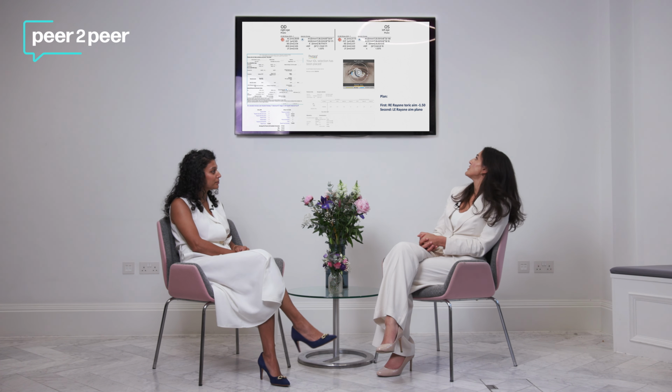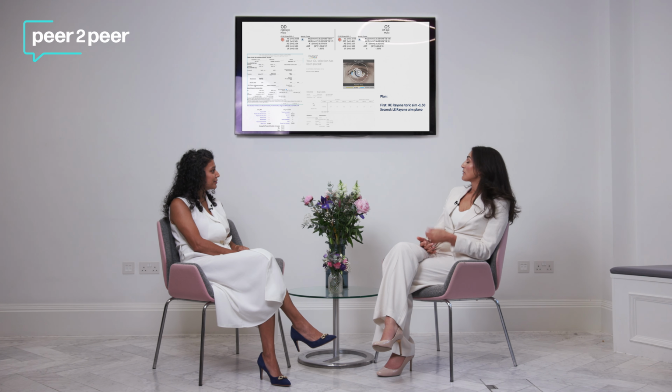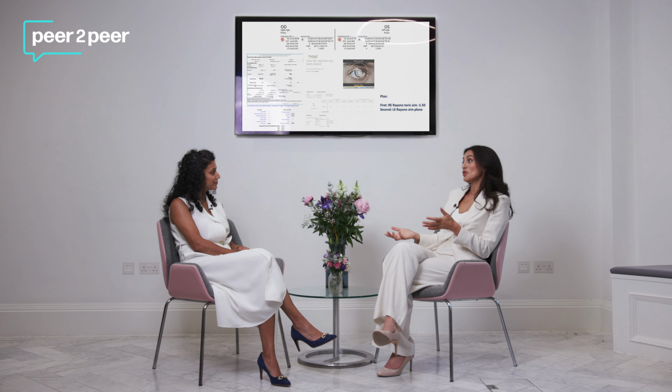Perfect. And for this patient, I decided to implant for the right eye a RayOne Toric lens, and we're aiming -1.5 like the patient had after the laser vision correction. So we implanted a RayOne Toric into the right eye, targeting -1.5, and I'm going to present the outcome of both eyes because about 6 to 8 months later, he contacted me saying that his left eye had now deteriorated and he wanted the left eye doing. So I'm going to show you the results for both eyes. And with the left eye, we did target plano.